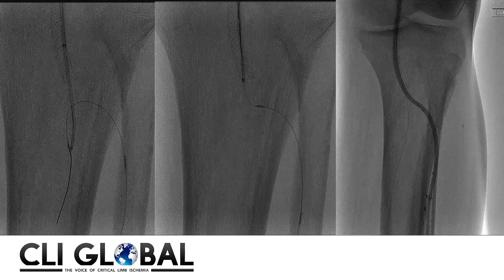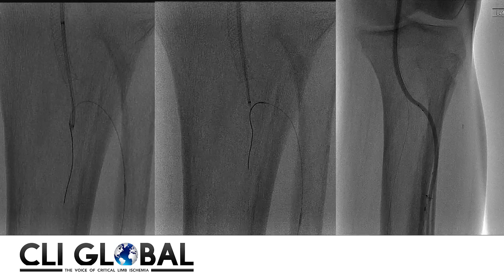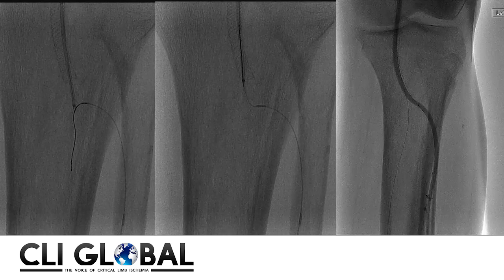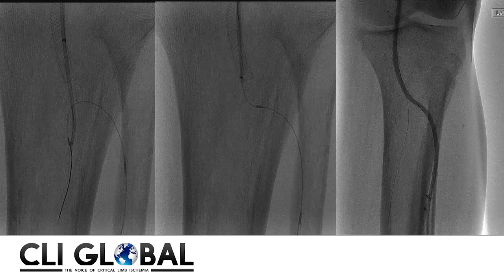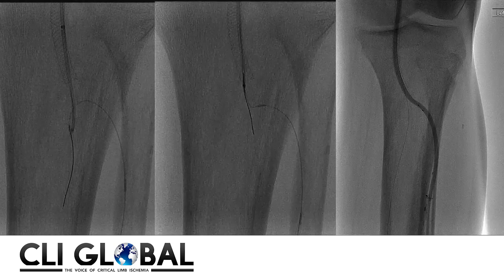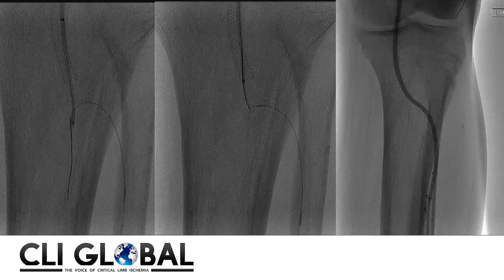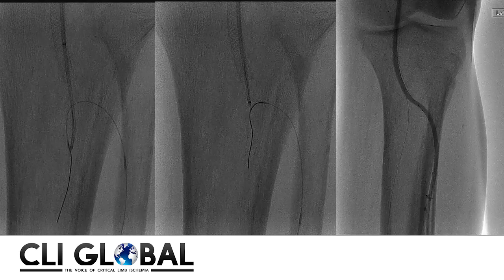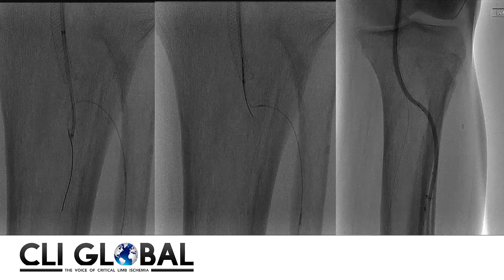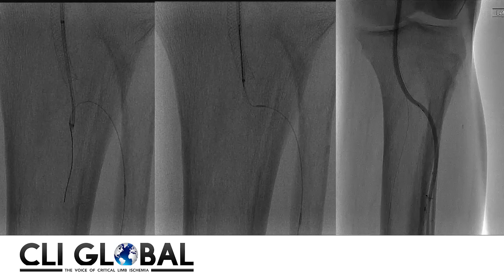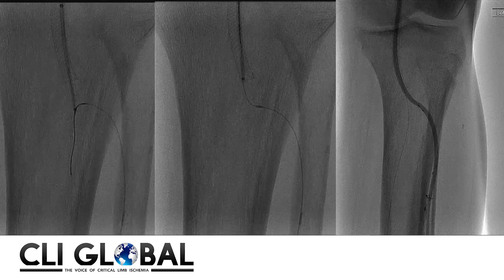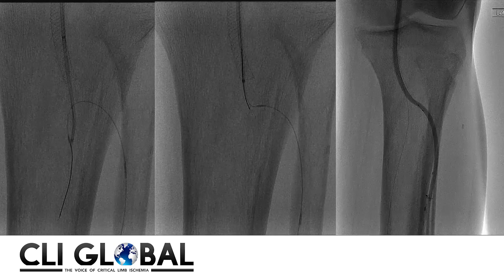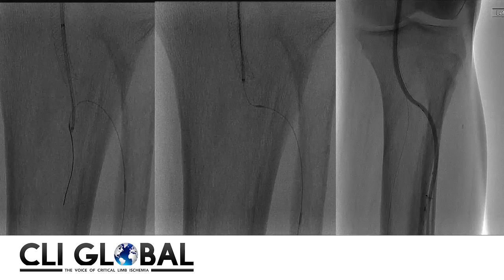We retrieved the wire through our snare and advanced it into our Navicross catheter from the anterior tibial artery. What you see on the right side of the screen is balloon angioplasty being performed through the popliteal artery into the anterior tibial artery.